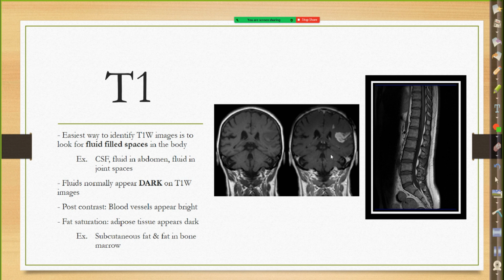But look here, these are normal blood vessels. You've got your venous structures here, more vessels covering the brain here. You have your choroid plexus within the ventricles. And then you do have a vascular-fed pathology. So this is a T1 with contrast.